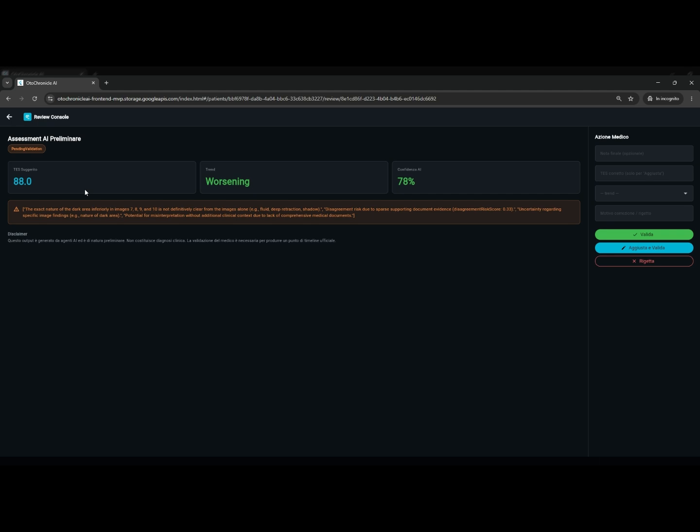Third, and this is where the AI lives, a Python agentic runtime built on Google ADK and Vertex AI with multimodal Gemini, also running on Cloud Run. It's an asynchronous multi-agent orchestration where every agent has a precise responsibility. There are exactly 3 agents and they execute in a sequential pipeline.